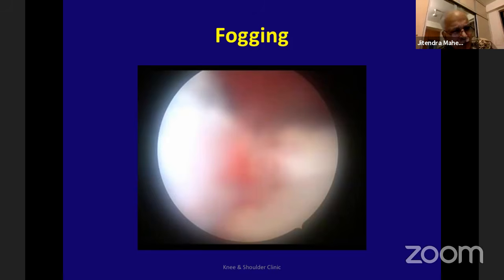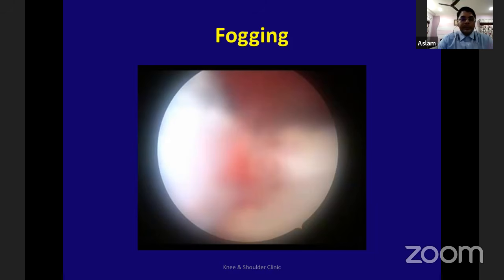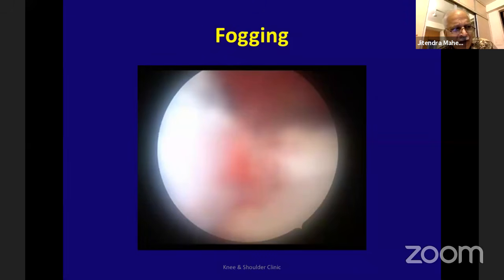Your first point is about the ligamentum mucosum being confused with the cruciate ligament. I think that's a learning curve issue, and you should start looking at the knee completely only once you can see the notch of the joint.